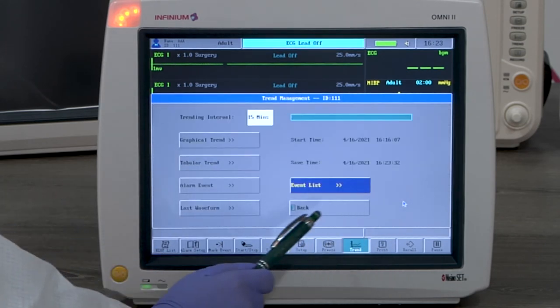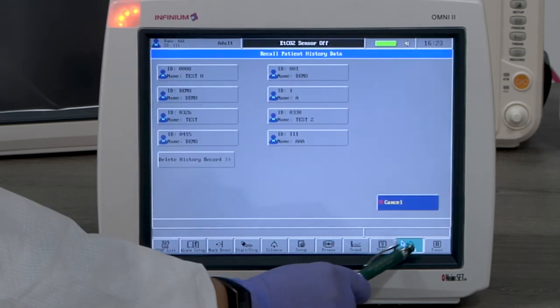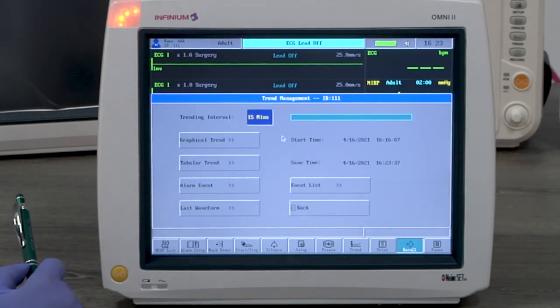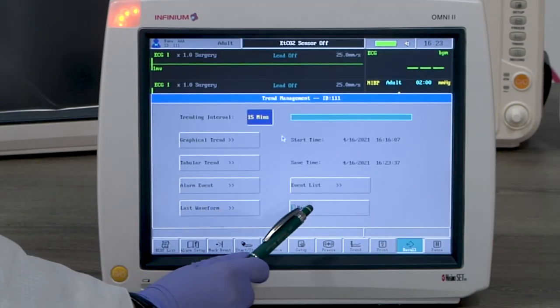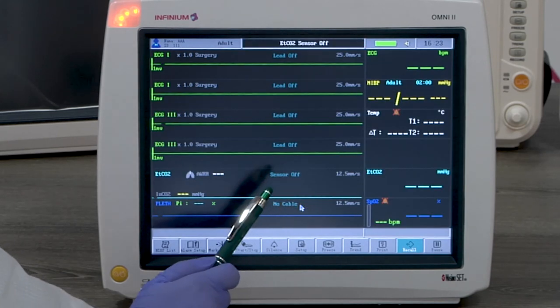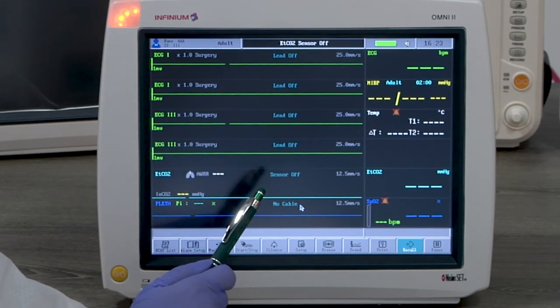Recall button will bring up stored patients for the user to review their trend data. The monitor can store a maximum of 8 patients. Entering a 9th patient will automatically delete the first patient.